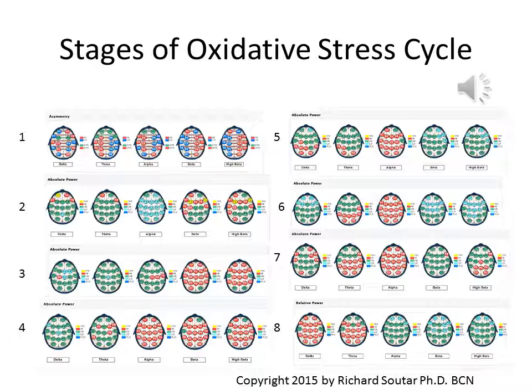deficits in perfusion in the brain. Theta is starting to dominate as a diffuse event. Alpha is still there. By the 8th stage, even alpha is beginning to diminish, and theta and delta dominate the map. And this is often the type of map we see in Parkinson's and dementia.